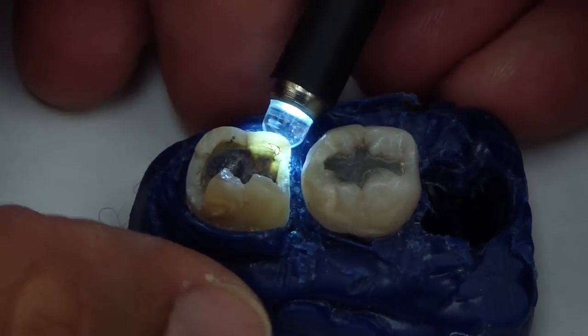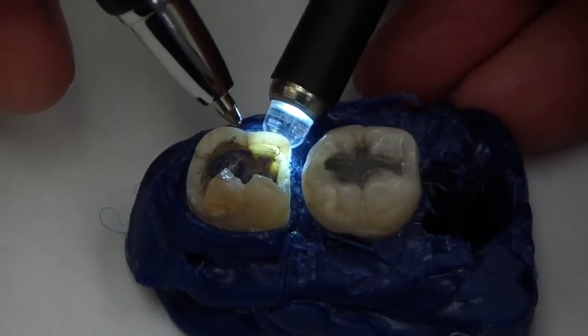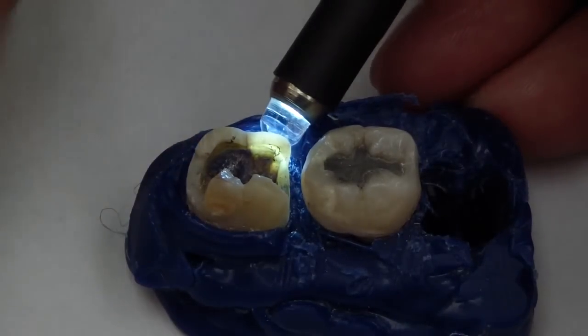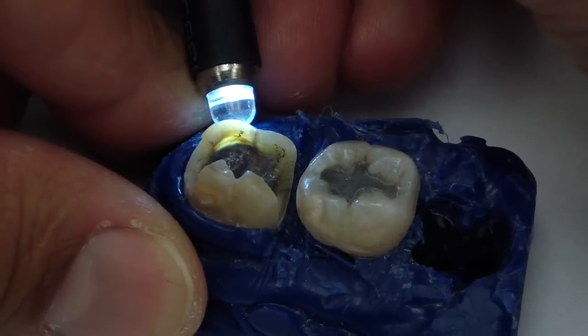You can see how when we place it on this lingual cusp, the light is attenuated — it doesn't continue. You can see, well, there's a crack right there, it stopped. The light doesn't go past that. And as we bring the light forward to it again on this side, the light is almost stopped going through that.